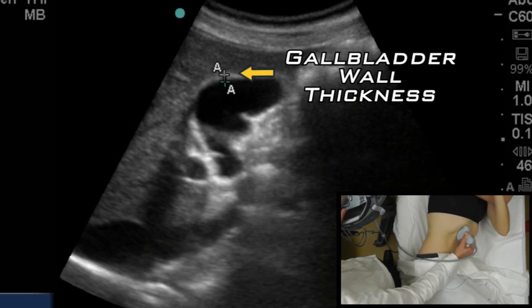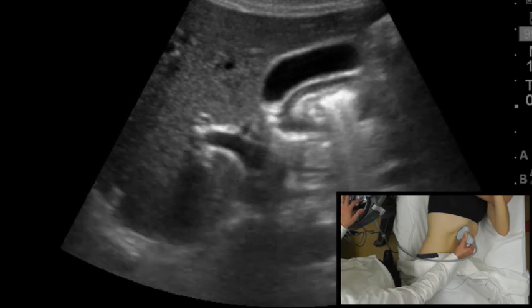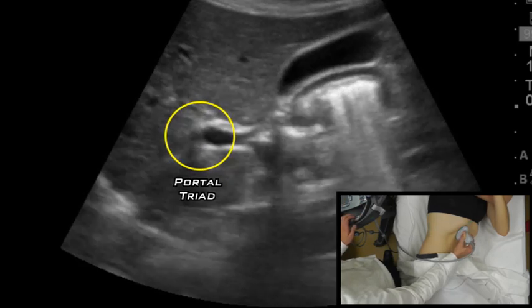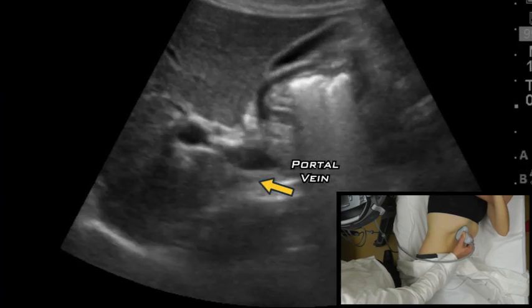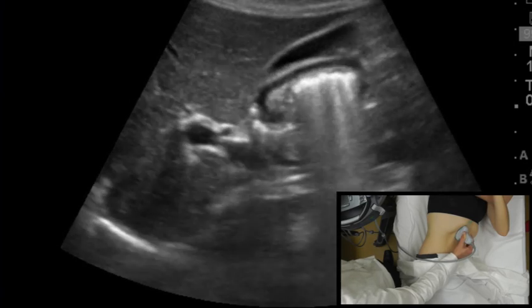You're going to want to follow the neck down and see the portal triad — the Mickey Mouse sign as people refer to it. You can see the portal vein there, and then you can also identify the common bile duct and the hepatic artery. On your left is the common bile duct; on your right is the hepatic artery.